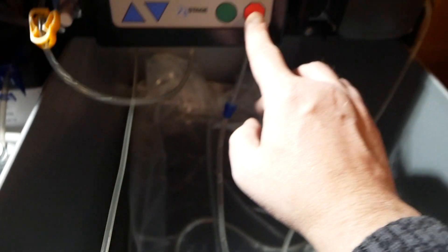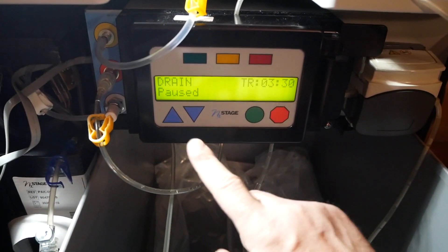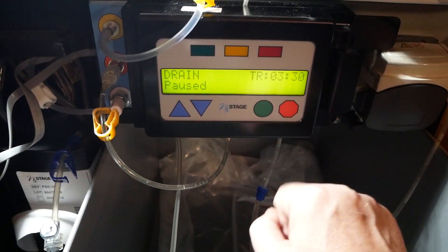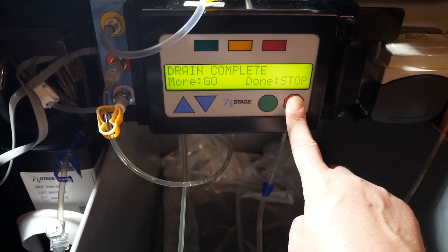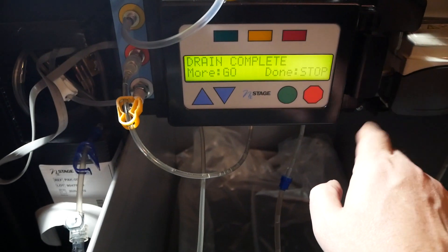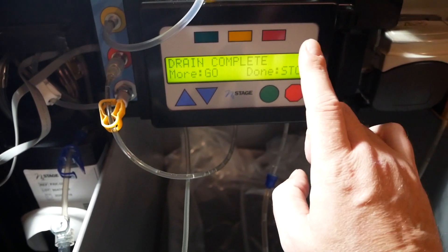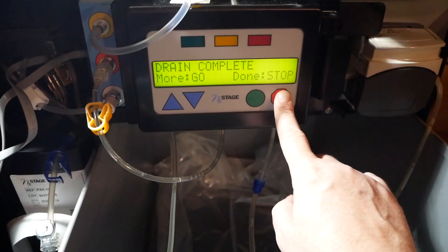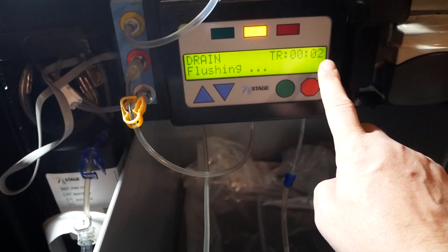We can stop that by hitting the stop button to pause, then hold down the stop button again and it'll say 'drain complete' - in other words, do you want to drain more or are you done? And we are done.